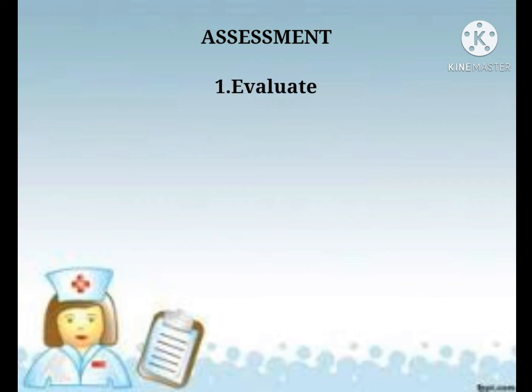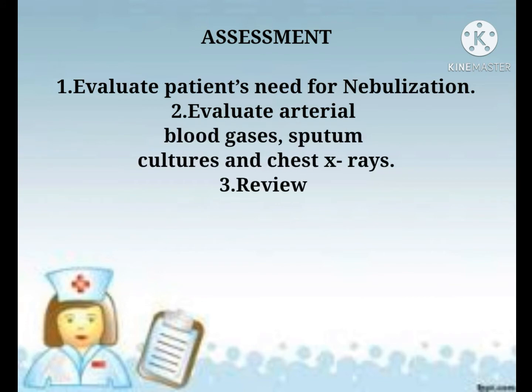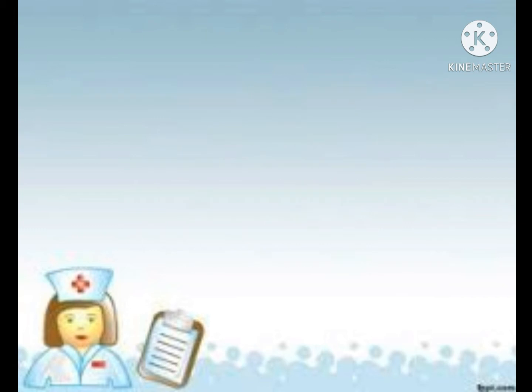Assessment. Evaluate patient's need for nebulization. Evaluate arterial blood gases, sputum cultures, and chest x-rays. Next is review the physician's nebulization order for length of treatment and medications to be used.